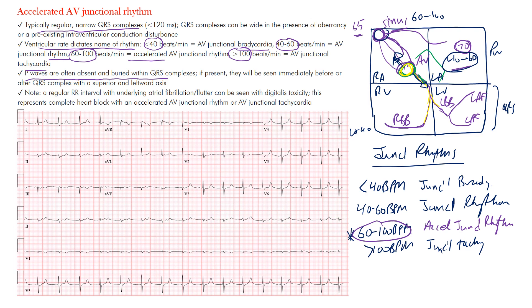Looking at this EKG, it's best to look at V5. Notice there is no P wave preceding any of the complexes — no P wave at all. It's a regular rhythm, meaning the intervals from one R wave to the next are the same. Measuring these out, there's no real difference between interval durations.